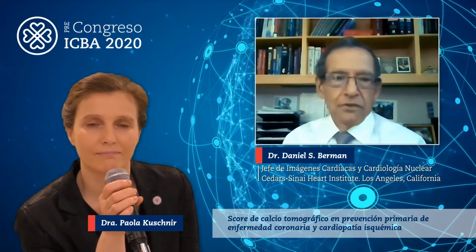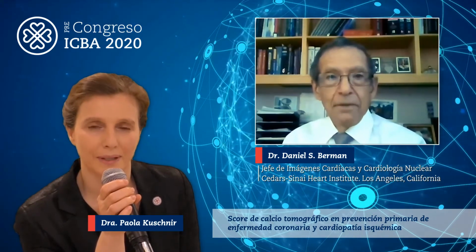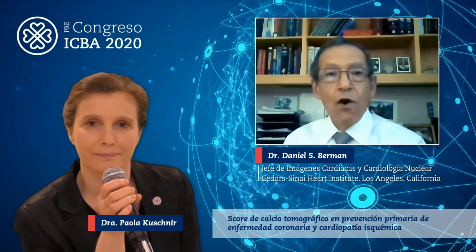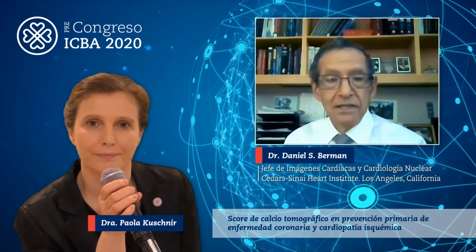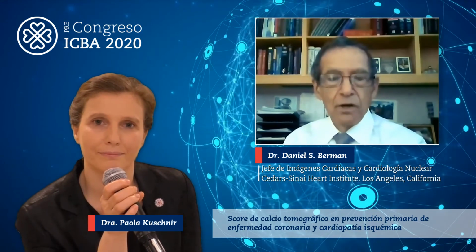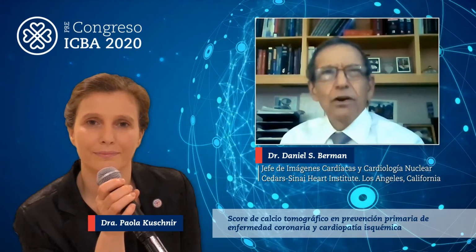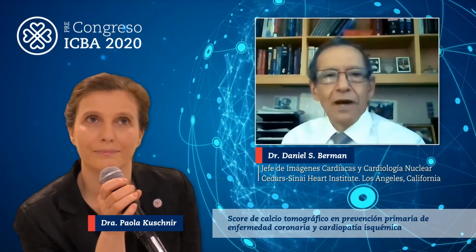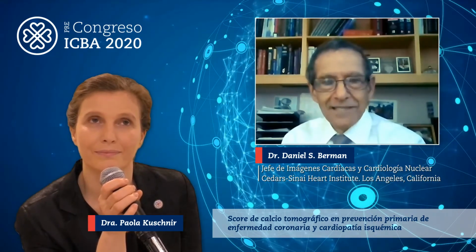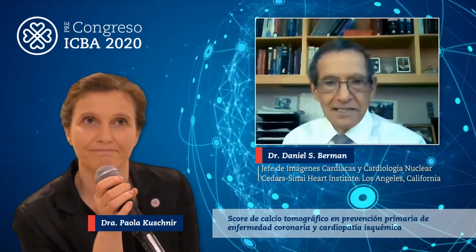And so we begin treatment even when the calcium score becomes 1. But it's very interesting how high a proportion of the patients in the intermediate risk group end up with a calcium score of 0. Somewhere in the range of 30% of patients who otherwise would have been put on statins end up with a recommendation that no statin is necessary.